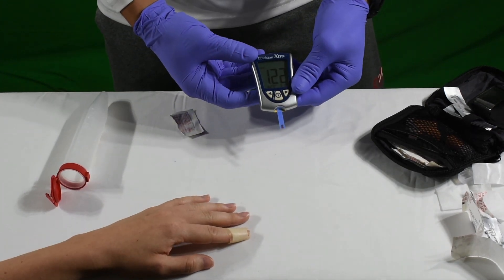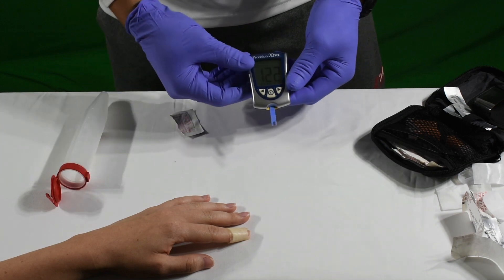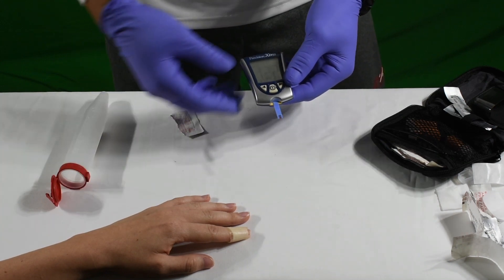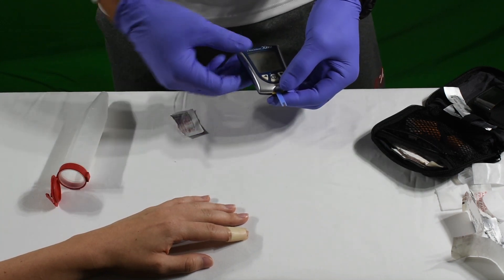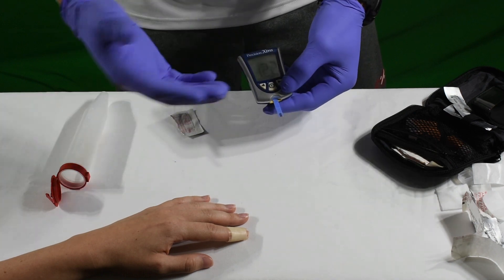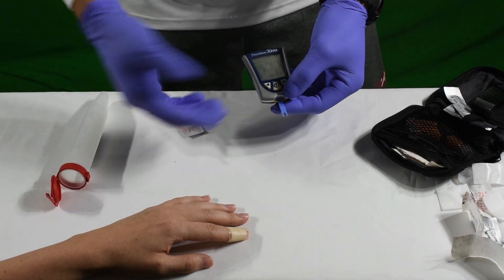Reading is 122. Usually the normal range is 80 to 120, but in the field it's based off your patient presentation, whether they have diabetes or not. So whatever their norm is. But the norm is usually 80 to 120.